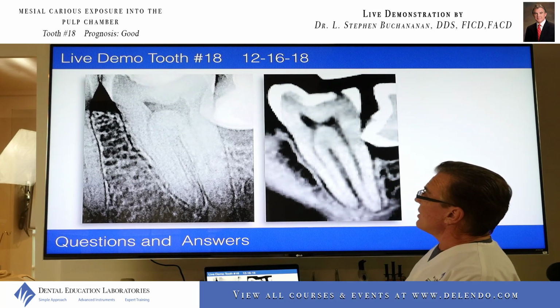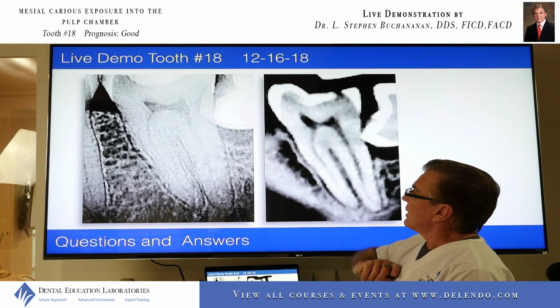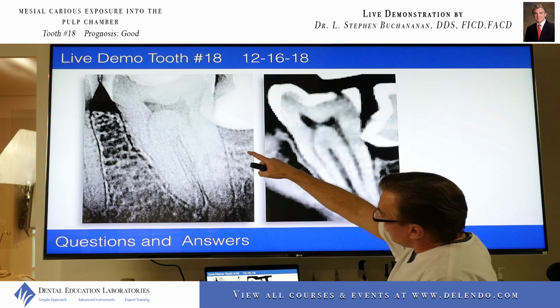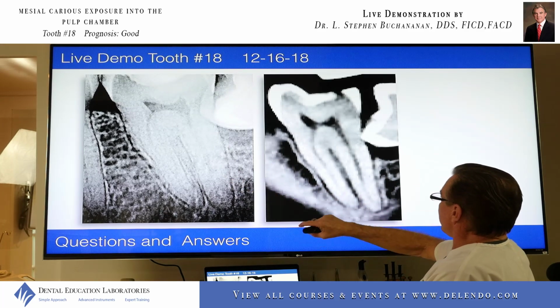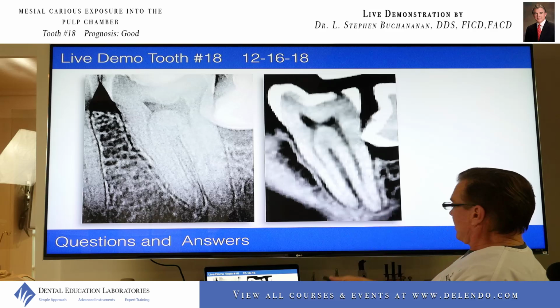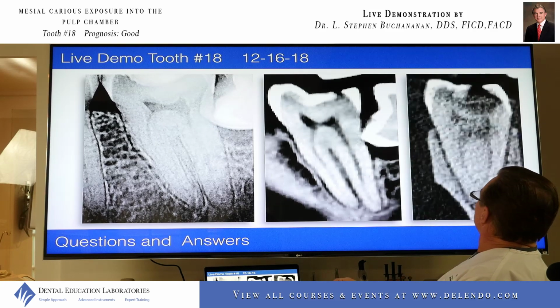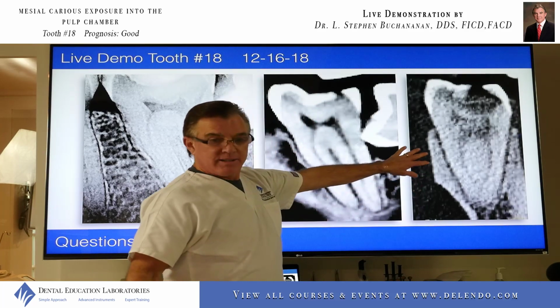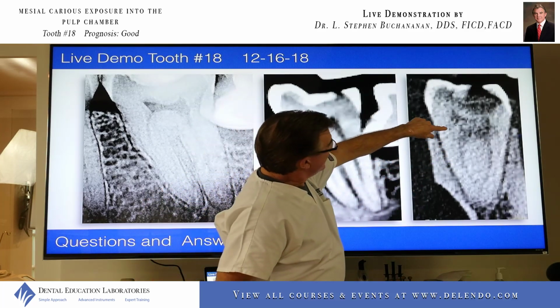It was one that had carious invasion of the pulp chamber. The pulp chamber is not too small, but the mesial root is really wiggly. It's very thin. You can see a little bit better over here on the CT actually. Let's pull up another image. This is difficult to see, but you can see it's a little bit rough.